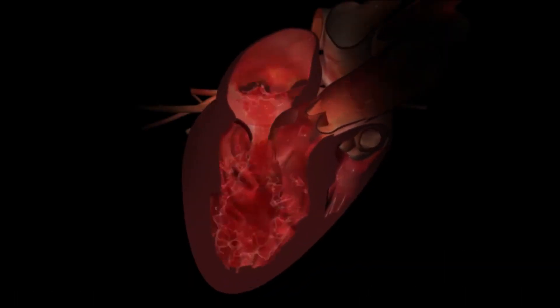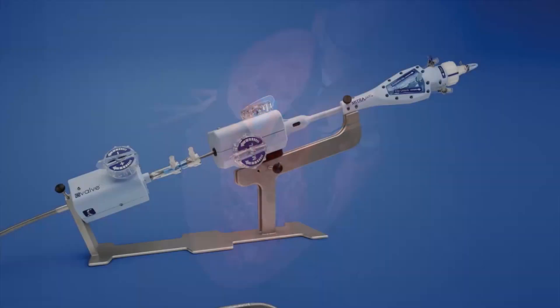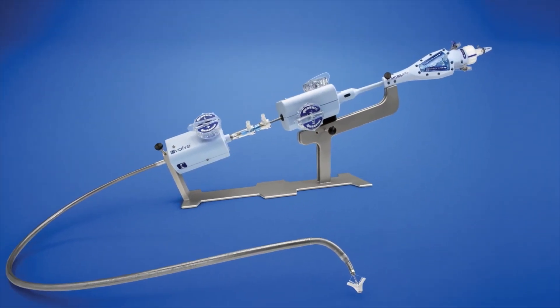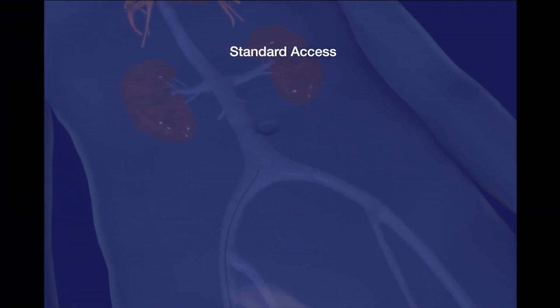The blue flow filling the left atrium illustrates severe mitral regurgitation, or MR. The percutaneous mitral repair system consists of catheters and the MitraClip device. The catheter is introduced over a guide wire that has been placed using standard techniques.